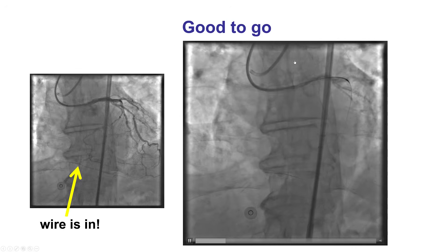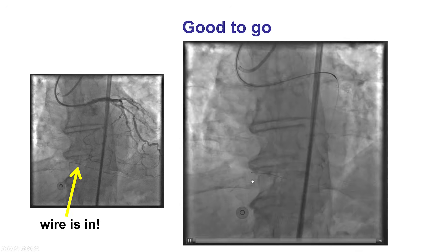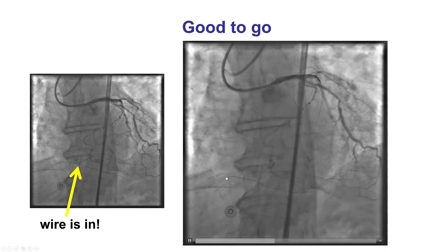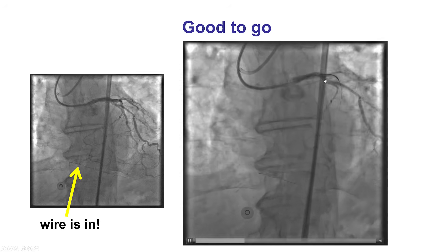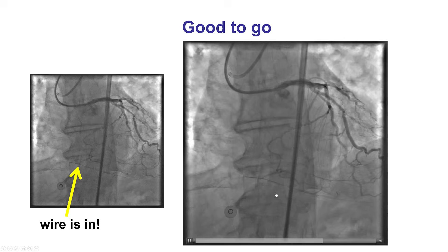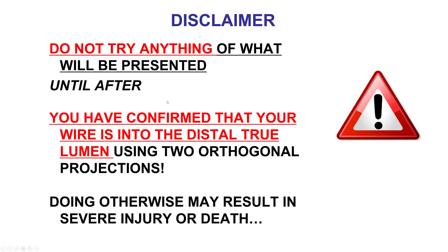Instead, what was done in this case is the wire was pulled back and repositioned, and now we see that the guide wire is indeed into the distal true lumen. Now is the time to advance the microcatheter over the retrograde guide wire. Nothing should be done before confirming that the guide wire is into the distal true lumen — that is true for wire-crossing collaterals, but it's also true for wire-crossing balloon and crossover lesions.